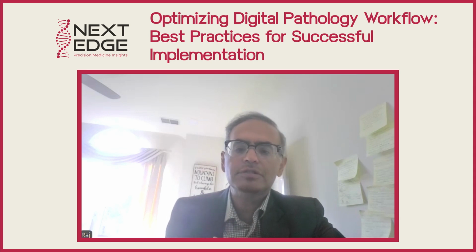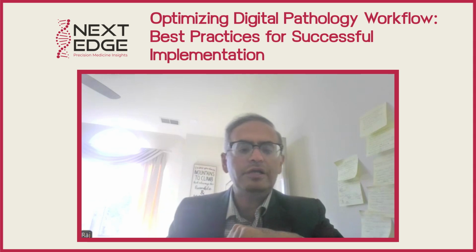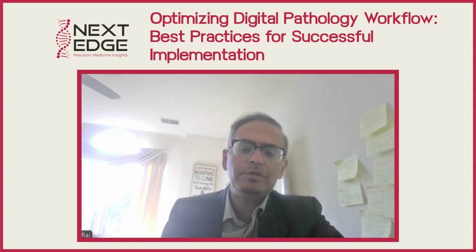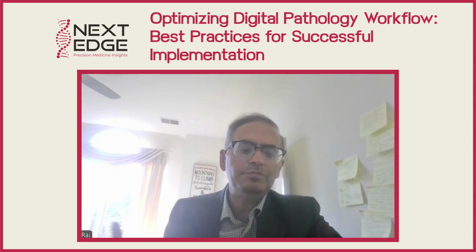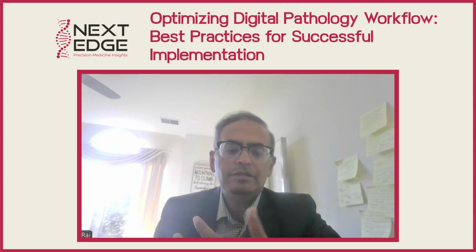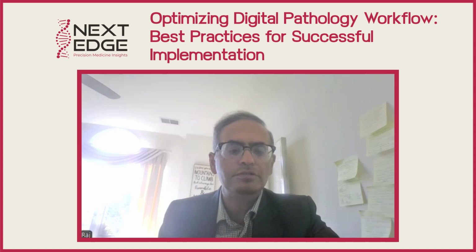But now with digital pathology, you can just digitize the image, and within a matter of minutes, you can easily get the slide across to the other pathologists wherever they are. And they don't even have to be in the office. They could be sitting at home. They might be on vacation. They can still look at your slide and immediately provide you with at least some kind of a preliminary diagnosis, and that would help the patient in a very big way. So that has been the biggest, I think, game changer for patients.